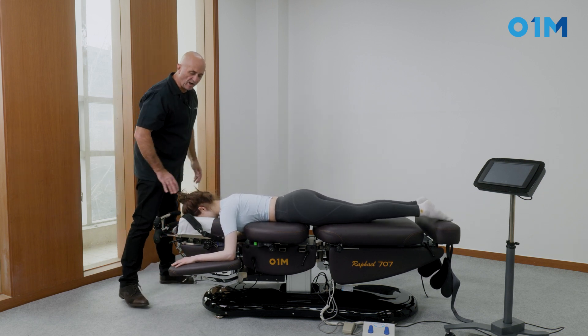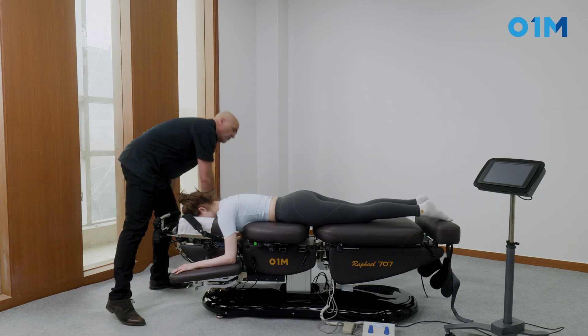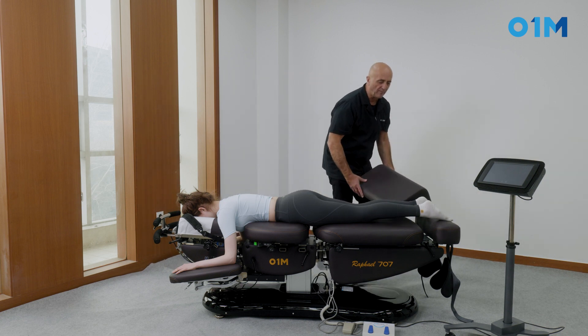She's going to rest her arms. We're going to make sure that we have the two arm rests well down so she's more comfortable, and then we will use a bolster.